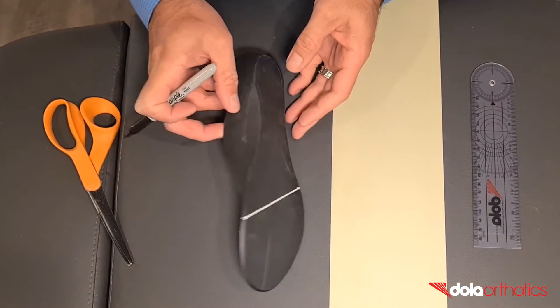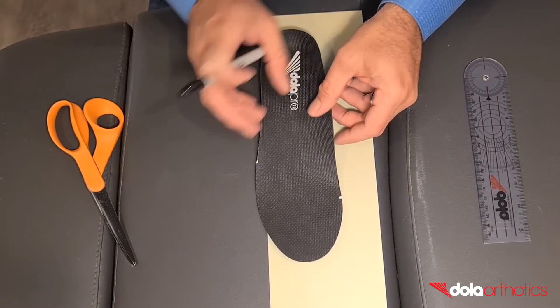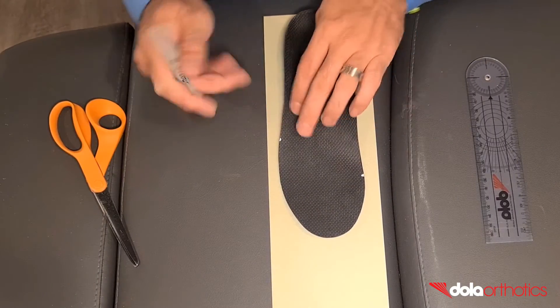For this addition, you will need a marker pen, ruler, DOLA gait plate sheet, glue, scissors, and a grinder.